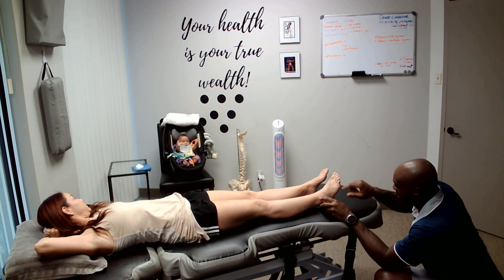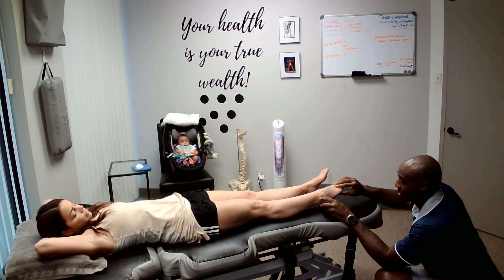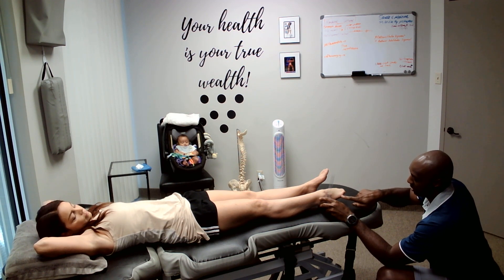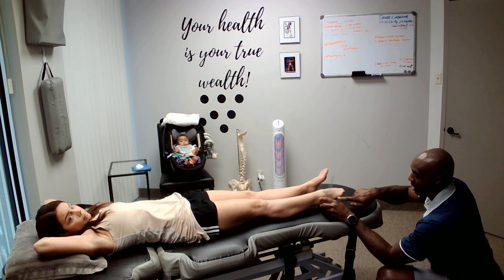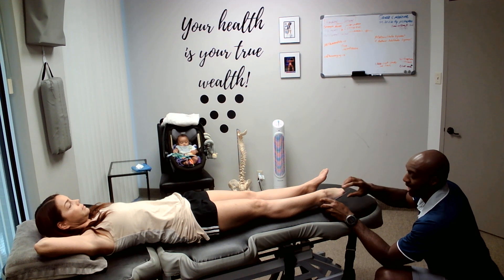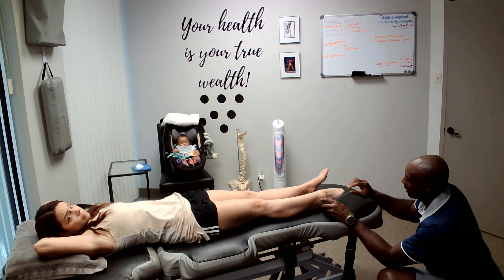The next thing we're going to do is have you go into plantar flexion as far as you can. From here, I'm going to line this up with the fifth metatarsal, or the pinky bone, on your foot — on that side. That way, we're going to have it parallel and in line.